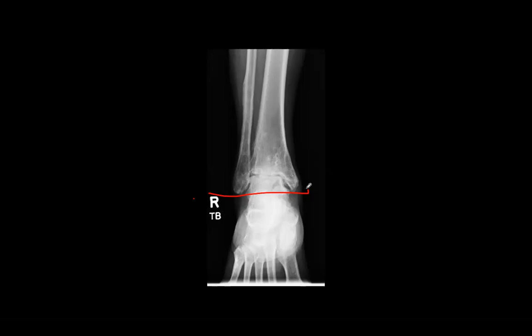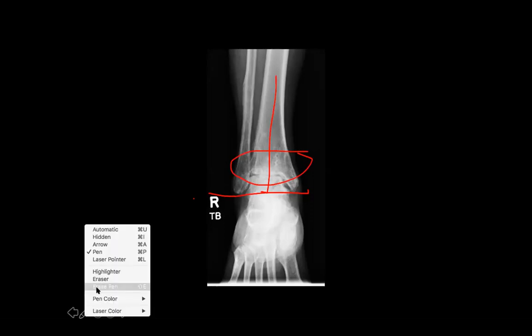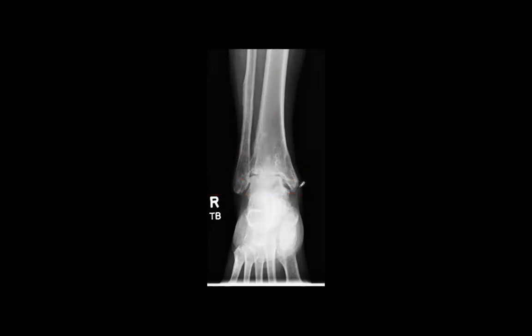So there's 2 different ways to evaluate the short fibula. One is the talocrural angle, which should be about 82 plus or minus 3 degrees. That one does not take into effect what happens at the distal tibia though. So if you think you have maybe something abnormal with the distal tibia, we can look at the plafond malleolar angle, which should be about 9 degrees.